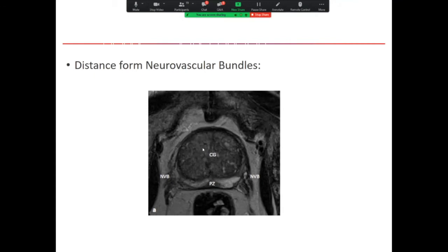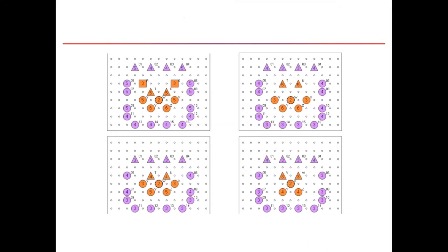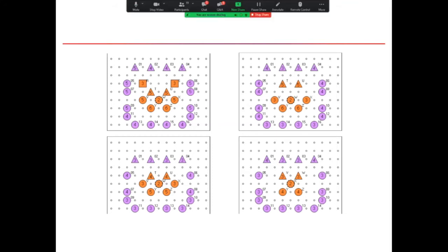In the MRI, as you can see, for example, the neurovascular bundles, which are on the bottom left and bottom right, are one of the things we'd like to avoid. Usually the seeding plan comes in the shape of charts like these, showing where the needles should be placed, like a grid. With straight needles, this is the matrix or grid where the needles go through where the circles are. So the algorithm is required to minimize patient trauma by minimizing the needle movements and the number of insertions, using oblique insertions to allow for seed placement.